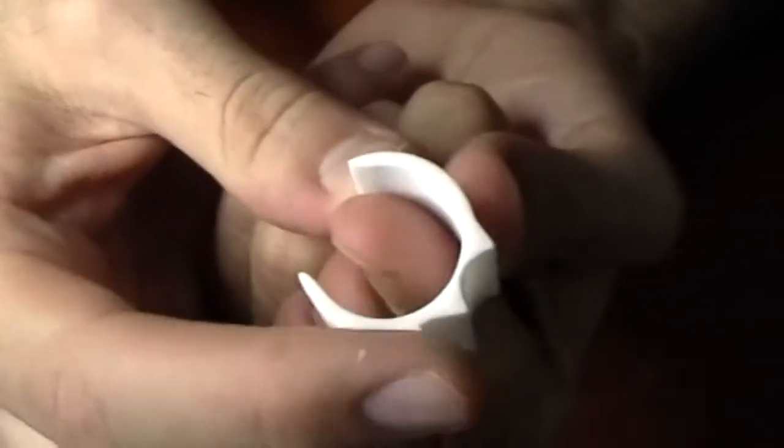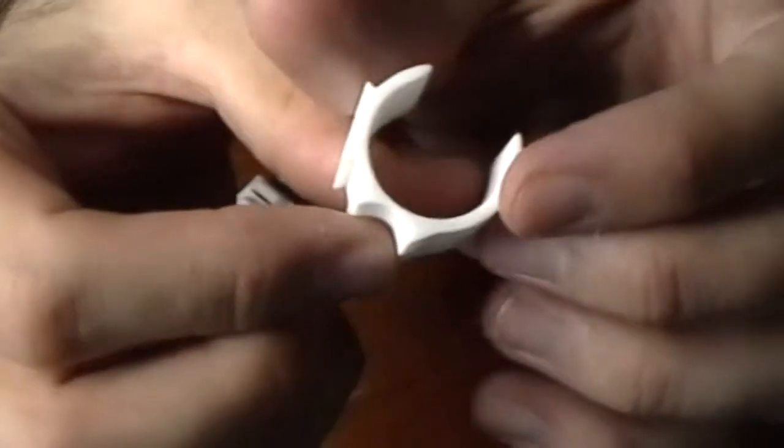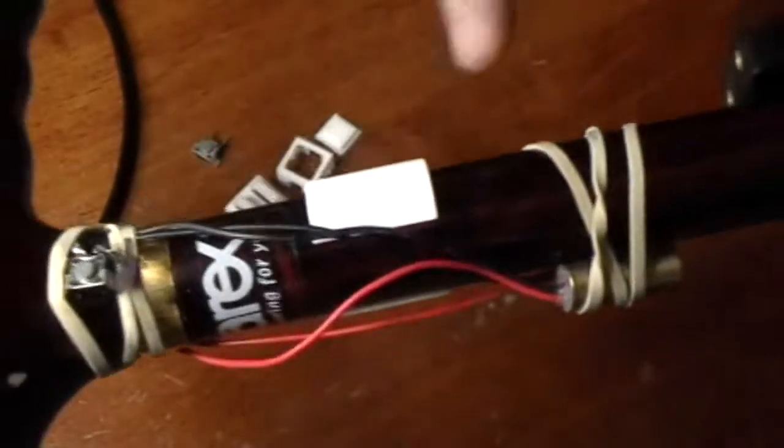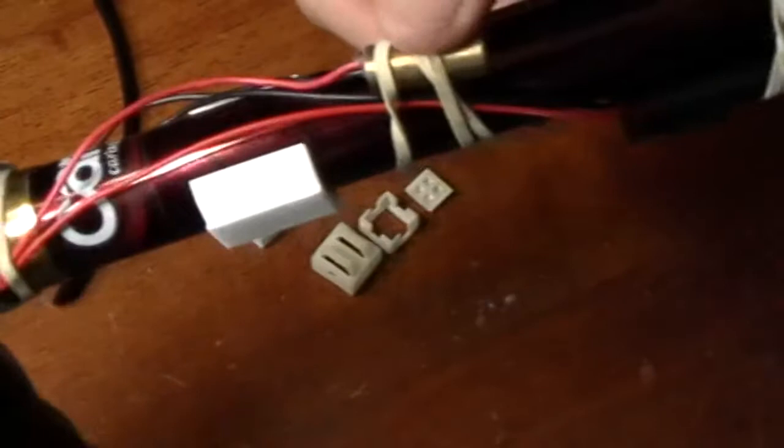The battery pack is supposed to be epoxied here, the laser module gets epoxied in here, and this snaps around the cane — it just snaps there like that. This holds everything instead of using rubber bands.